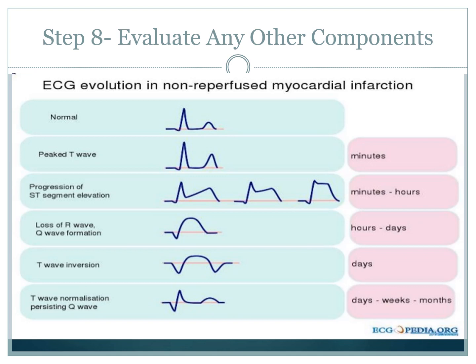Okay, so that's the 8 steps that you can go. As you can see, quite long. This is what we do in practice. Always practice, and then we get used to it. We don't do this in an emergency. Someone's on the table and they're in an acute state. We definitely don't do this. This is what we do at practice time, or when we have the time to hand over a good.